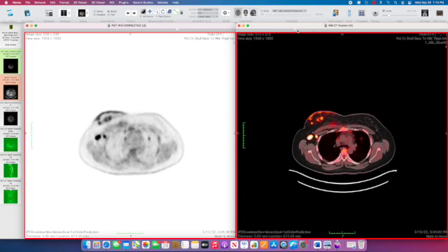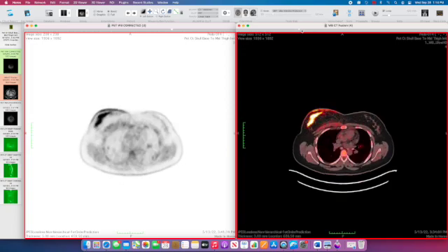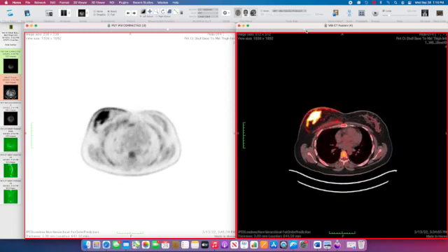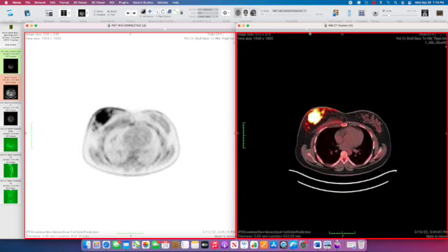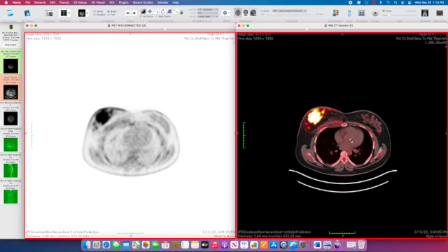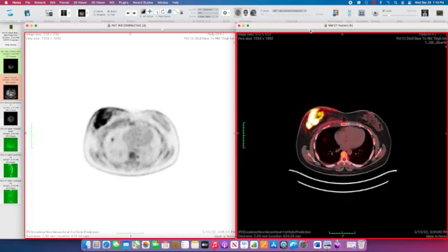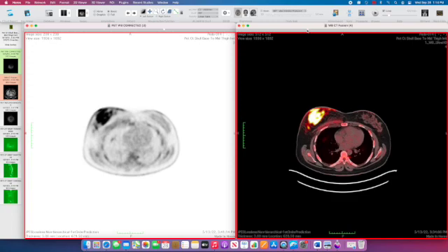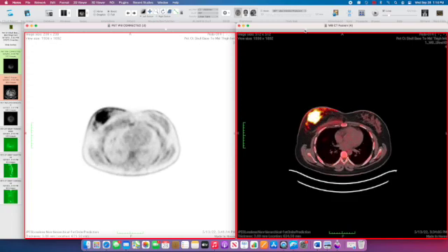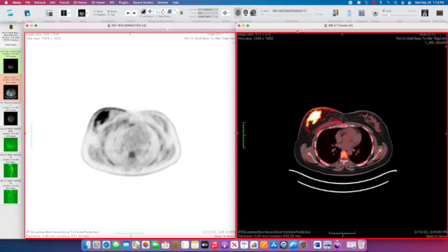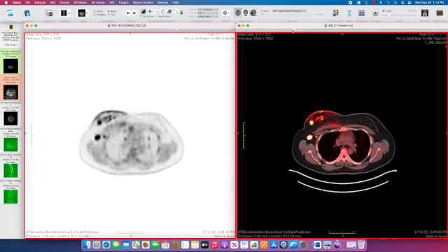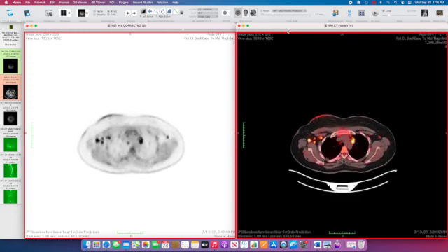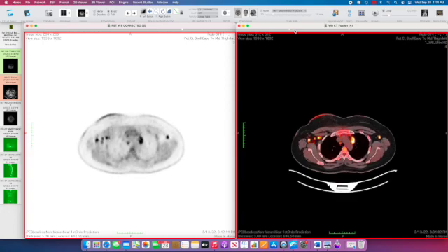As we continue down, there's a large, intensely hypermetabolic right breast mass here. There's also skin thickening and hypermetabolism of the skin itself. This is certainly suspicious for breast cancer with skin involvement—an inflammatory breast cancer appearance. As we mentioned before, we have lymph nodes involving the bilateral axilla and mediastinum.